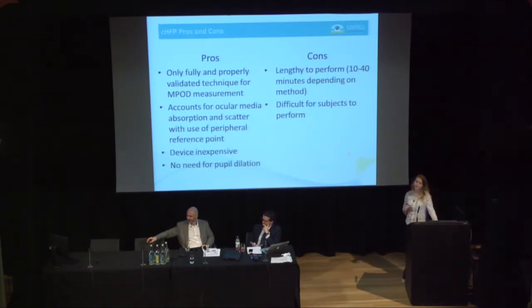Unfortunately, this method can be very lengthy depending on the method you use. Our method, which is very particular, can take up to 30 minutes. And also, it's difficult for some subjects to do, especially children, really old people, people with memory deficiencies.